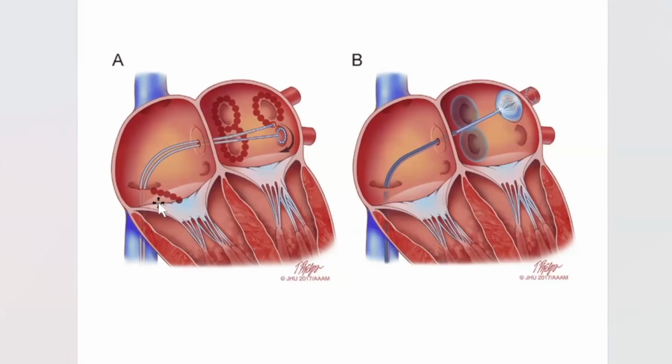Some patients also have this arrhythmia called atrial flutter. And for atrial flutter, we cauterize or ablate the area between the vein from the groin and the valve between the right upper and right lower chambers of the heart. That generally covers about 90% of AF ablation.